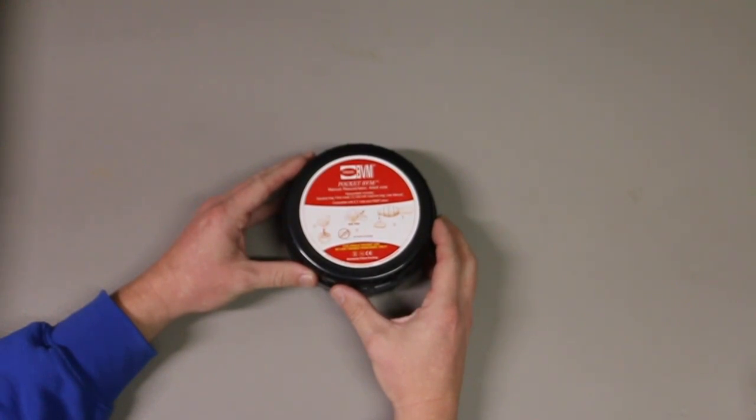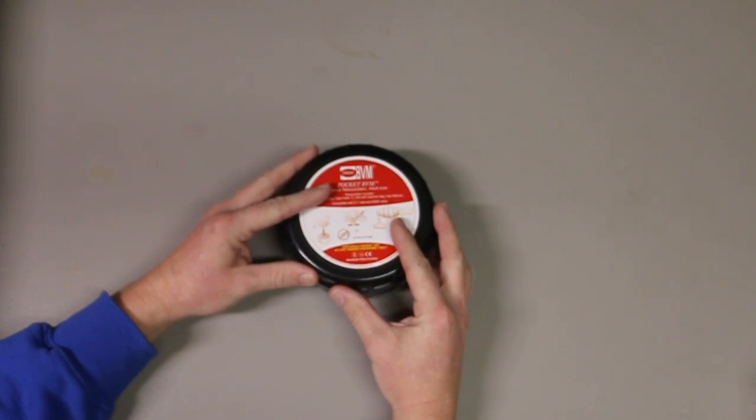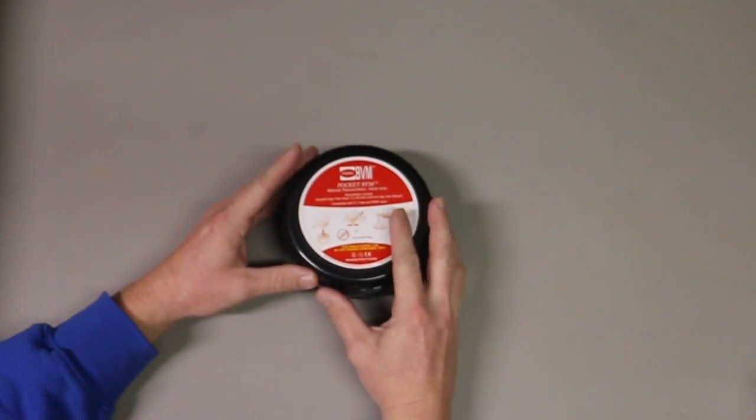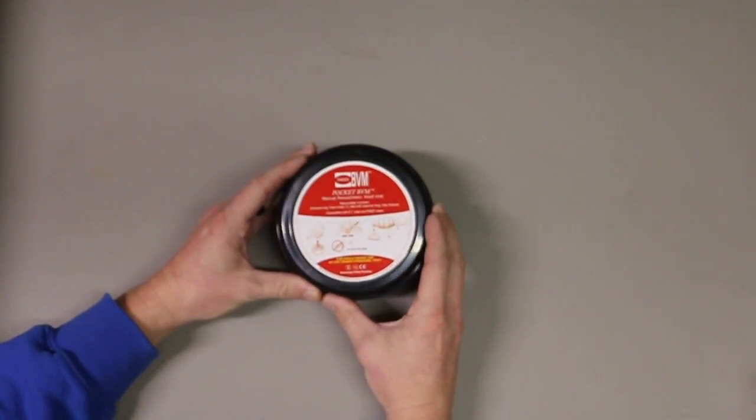Hey, welcome to another video from Medical Gear Outfitters. I wanted to give you a quick demo of a product that we just started carrying. We have a limited supply of these, so if you want one, I would jump on it pretty quick because there are limited supply on these.